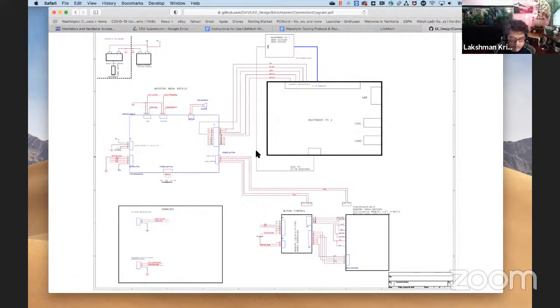Again, all the components are the same, the software is the same. They replaced the motor with a blower. And that particular version was not authorized by the FDA, I have to say that. It was a prototype, but I would like Jan to describe how he took this system and modified it to control a blower. Jan?